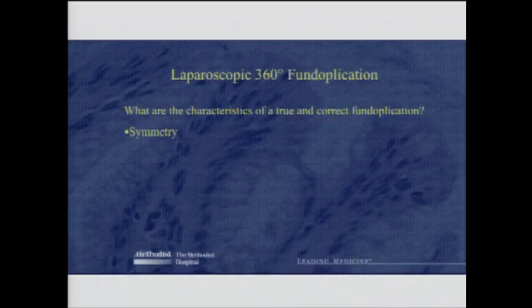Now, what are the characteristics that we look for? We want symmetry. We want a properly located fundoplication. The length is important. Obviously, how loose or tight it is is very important with regards to dysphagia. And then we would like our fundoplication to be oriented just the way God left it, with the short gastrics aimed at their bed after we've divided them.